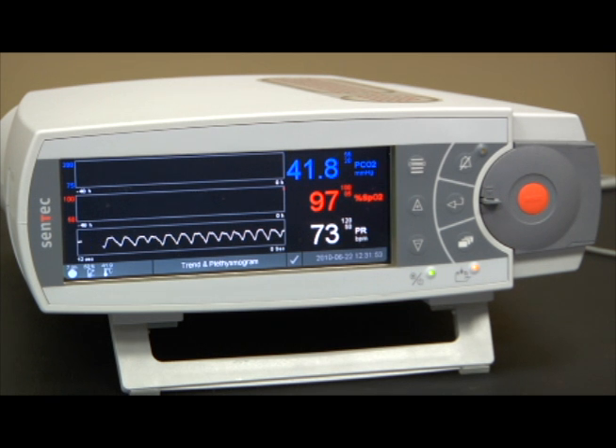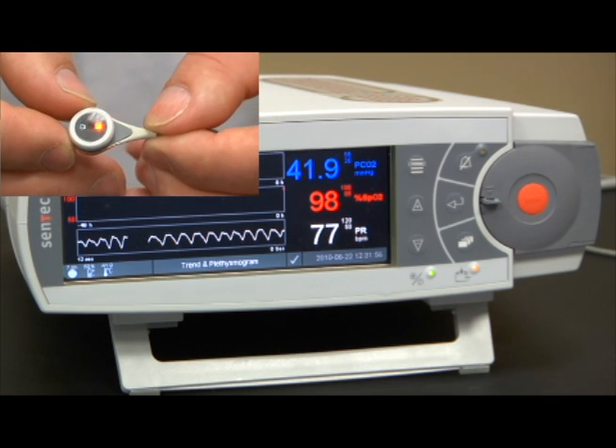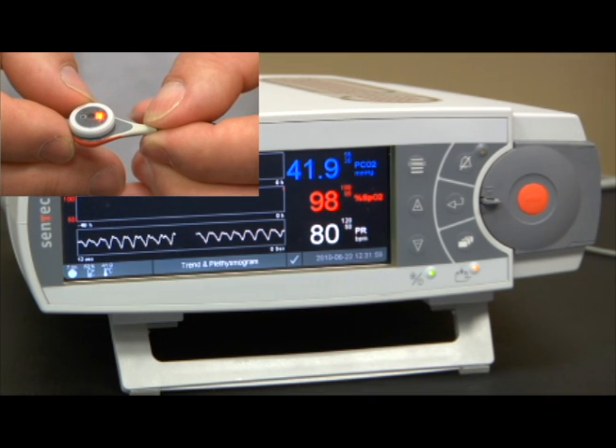Sensor calibration. Your SenTec digital monitor includes a state-of-the-art V-Sign sensor, providing measurement of transcutaneous PCO2, oxygen saturation, and pulse. PCO2 measurement is performed utilizing a patented digital Severinghaus electrode, providing fast and reliable PCO2 readings.